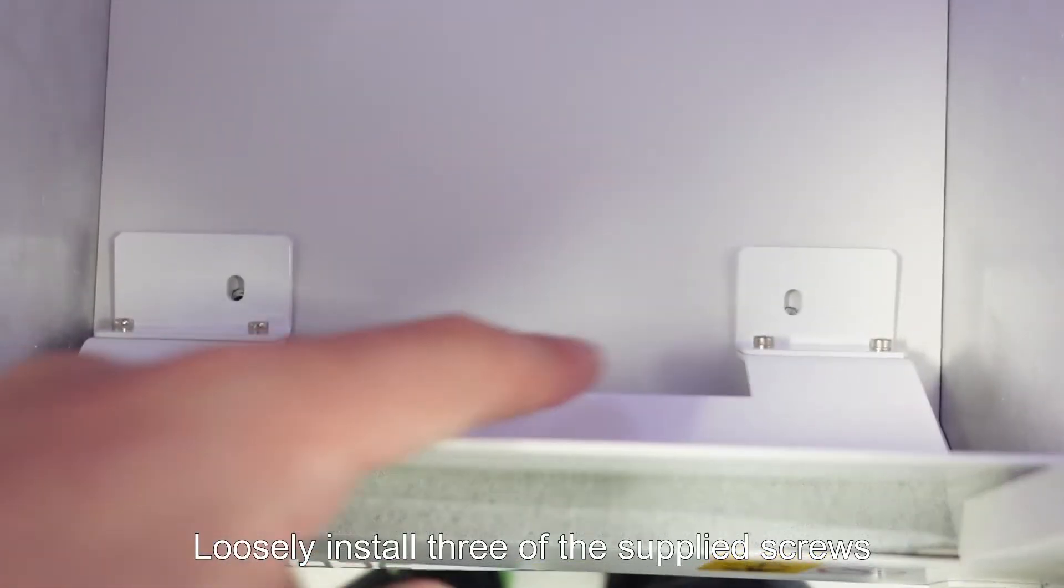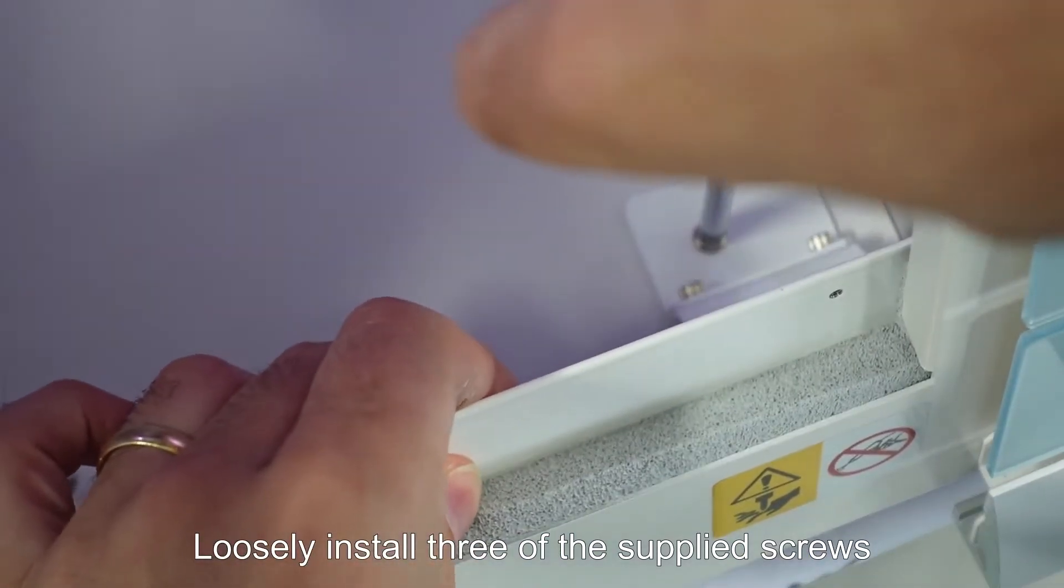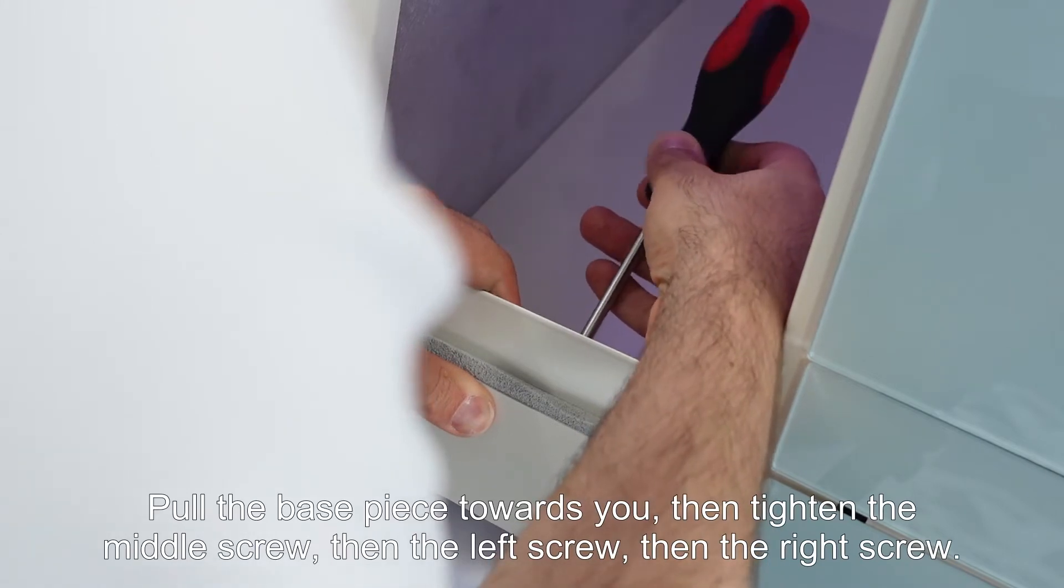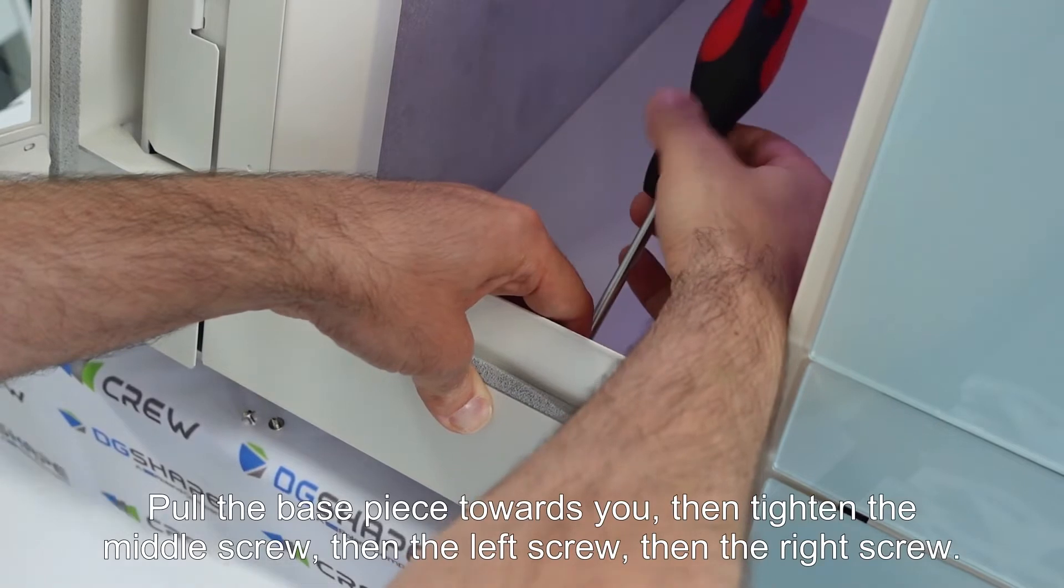Loosely install three of the supplied screws. Pull the base piece towards you, tighten the middle screw, then the left screw, then the right screw.